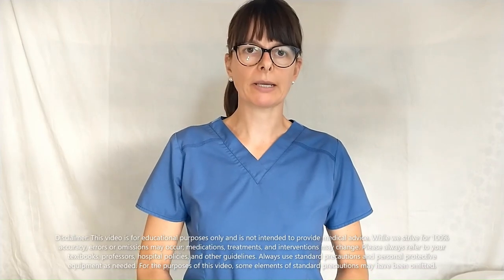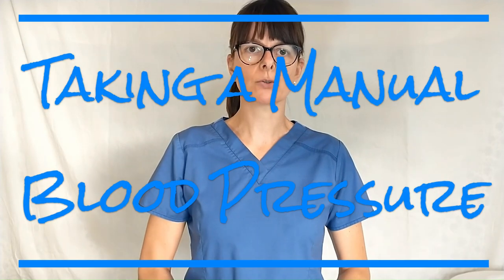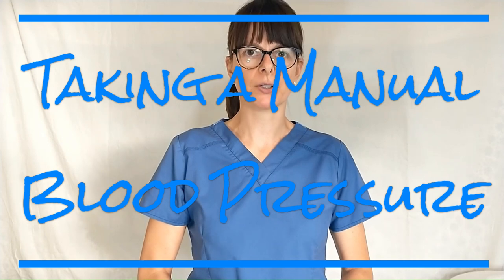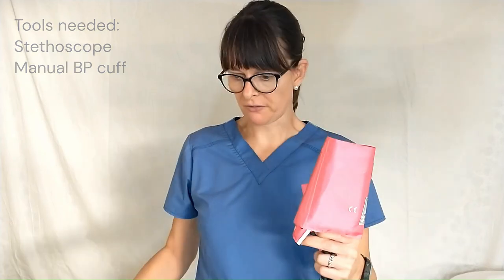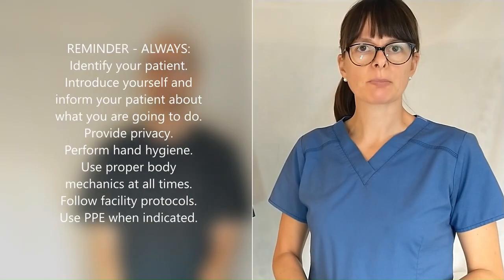Hi and welcome to Nursing School Explained. This video will go over how to take a patient's manual blood pressure. We need some tools for that: a stethoscope and a blood pressure cuff. Now let's take our patient's blood pressure.